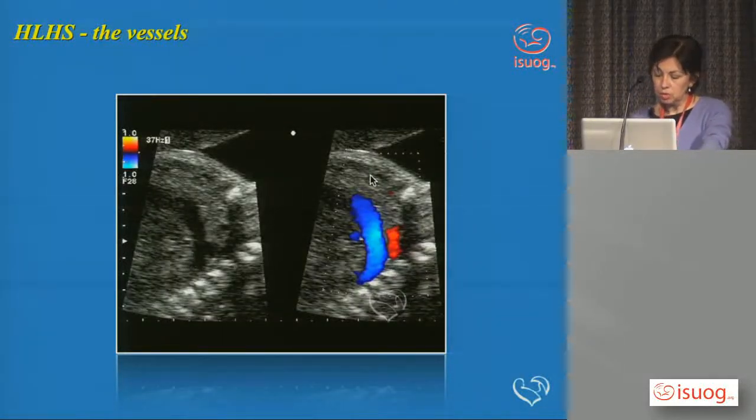Now, this is a sagittal view, and as I said, cases of hypoplastic left heart quite often have coarctation of the aorta, and although Dario is showing you a beautiful image of 3D and B flow, we can actually, on 2D, particularly if you use power Doppler, get similar pictures of the aortic coarctation shelf here. This is on normal color, but if you put a power image here, you can get more persistence on that.